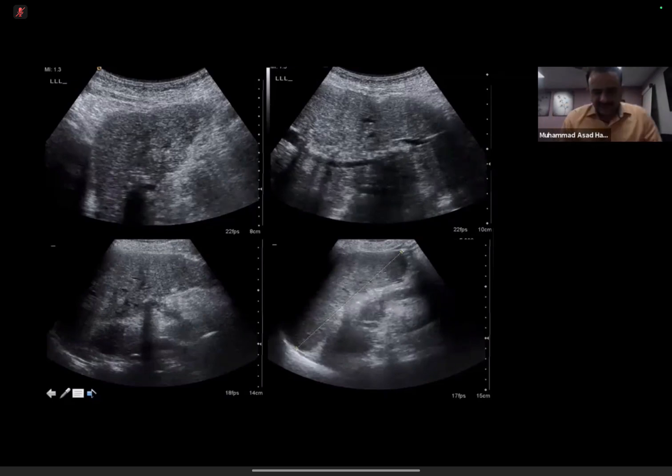You described it well and went to the diagnosis, but the only recommendation I'm going to make is that you should describe it straight away, not just say it looks like a cirrhotic liver. The examiner wants you to describe that it has a slightly heterogeneous echotexture, the surface is irregular, no obvious lesion, likely cirrhotic liver disease. The image on the right bottom of the screen shows a slightly enlarged spleen.